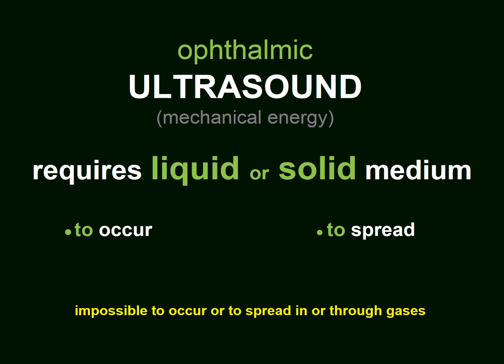Ophthalmic ultrasound is a mechanical energy. It requires liquid or solid media to occur and to spread. It cannot occur or spread in gases, in air. That's true for the ultrasound used in ophthalmology.